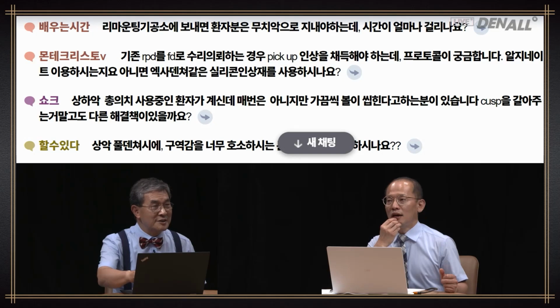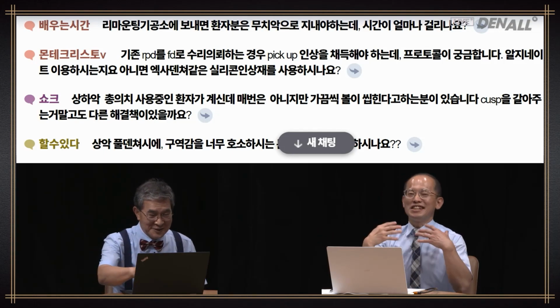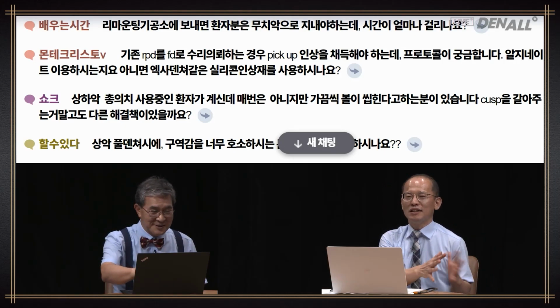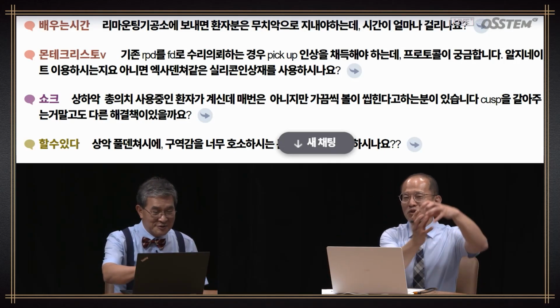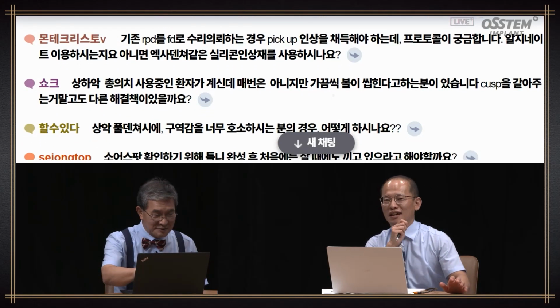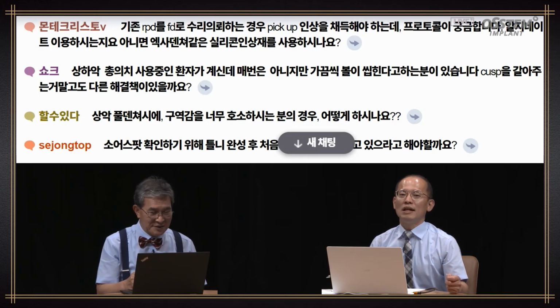So, remounting. While the remounting is in the technician's hands, the patient stays, so what do you do? Well, you only need 1 day. Is it always 1 day? I always make it so that I can return it after 1 day. So you need a good relationship with the technicians or lab so that it can come back quickly. But I think 2 or 3 days is sufficient.